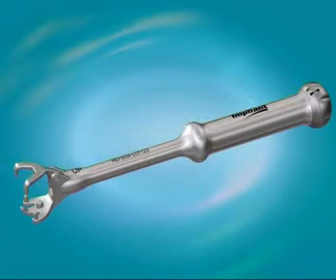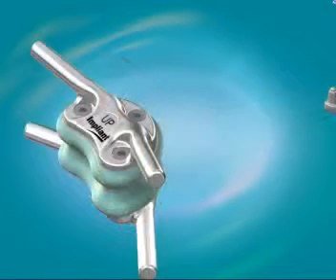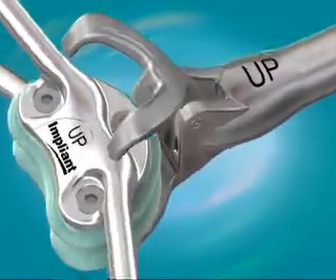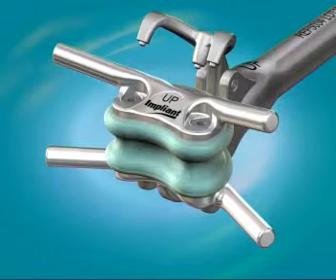The next step is to attach the device to the TOPS holder, which is used for proper implantation of the TOPS system. Open the holder tongs by turning the knob on the end of the handle in a counterclockwise motion to prepare the instrument for grasping the TOPS device. Place the holder's tongs over the TOPS implant, verifying that the holder's up marking matches the TOPS up marking. Be sure that the 3 holder tong pins match the opposing TOPS socket pins.